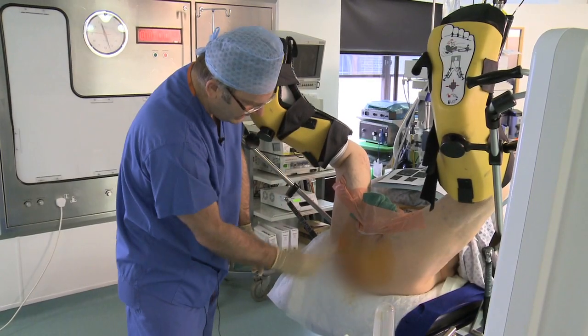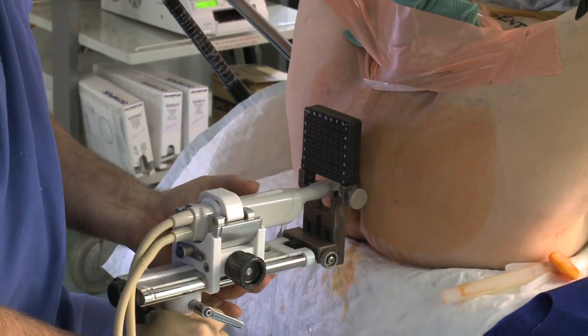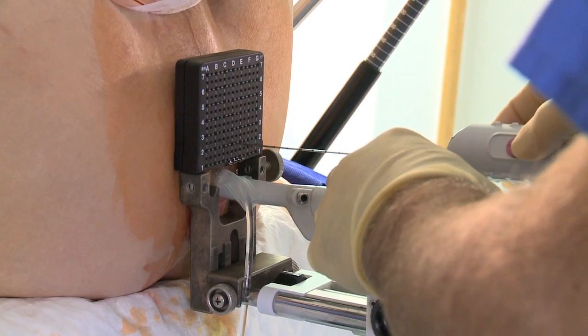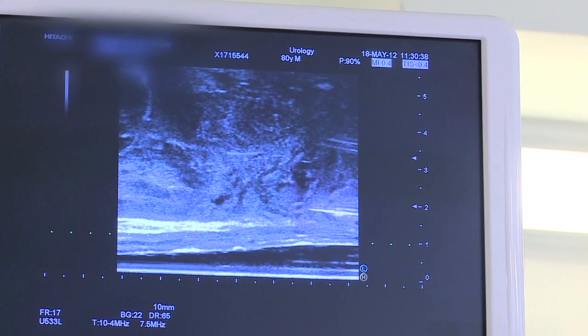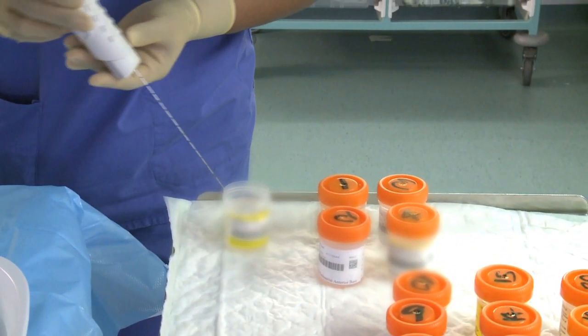And in the last few years, we've become better able to diagnose people by using more guided biopsies in a more systematic fashion. So we've started moving from transrectal to transperineal biopsies and using a grid to focus where we place the needles so that we can systematically sample the prostate gland more reliably than we could ever do before. The beauty about template biopsy is that it avoids the risk of sepsis and also gives you the opportunity of interrogating every single part of the prostate, should you wish to do so.